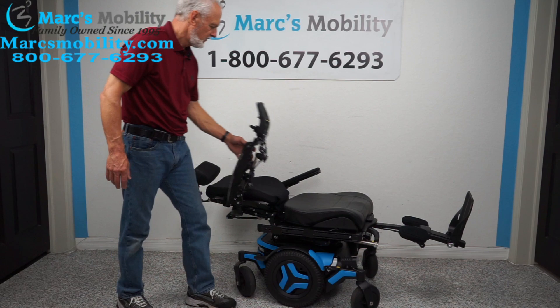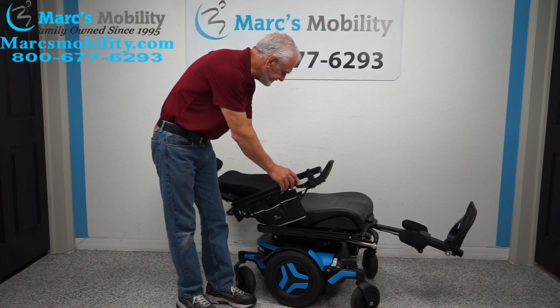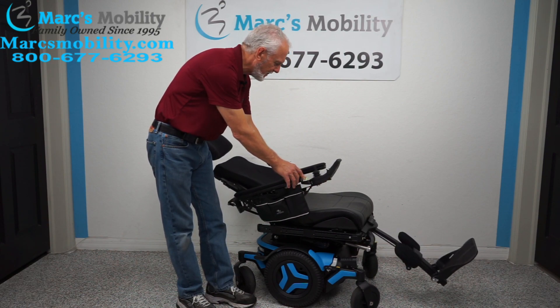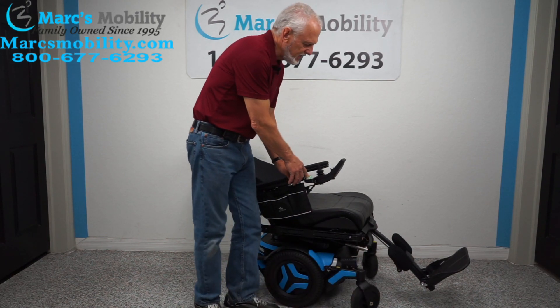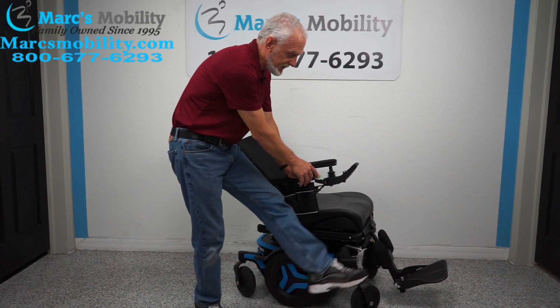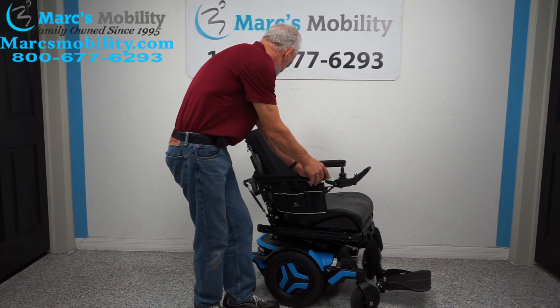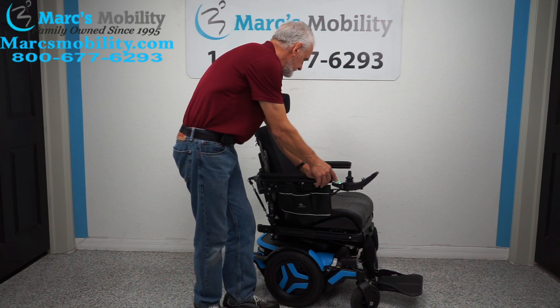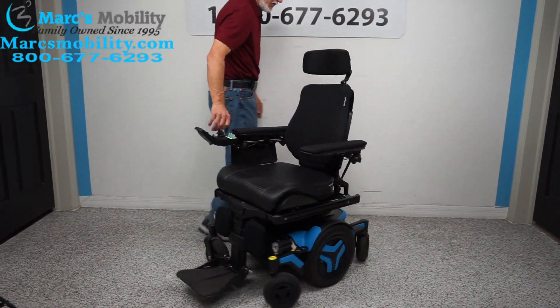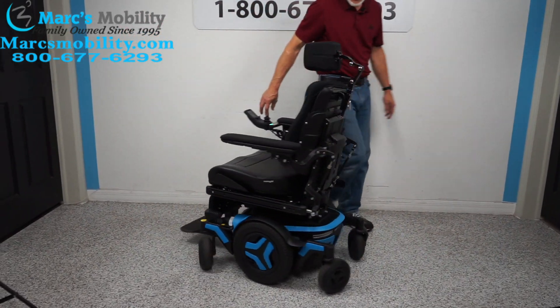The recline goes back until you're laying nearly flat. Let's bring the back up and the legs down — you can do two buttons at once, or the same thing through the joystick with one button. Now I'll bring the legs all the way in to show what it looks like indoors. Look at that turning radius — it can turn almost completely on itself. That chair will turn all day long in the same circle.